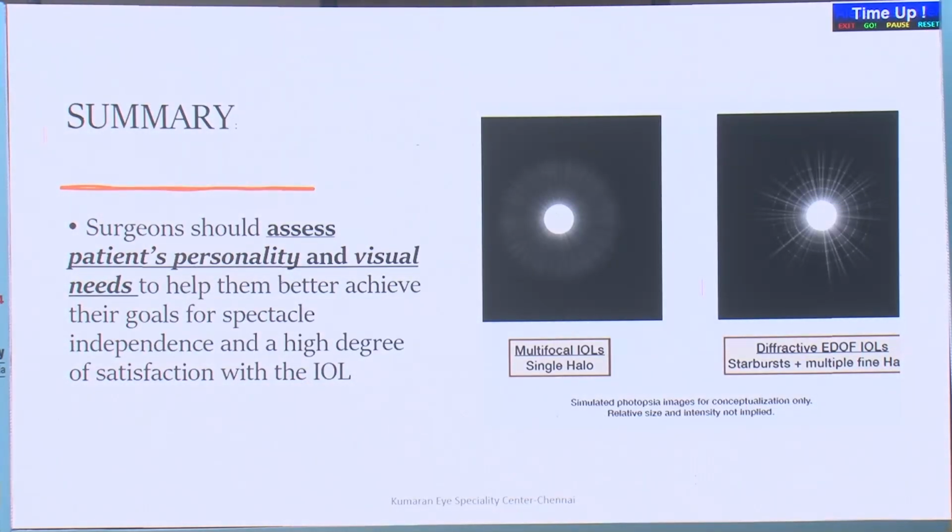So finally, with all these studies, talk with your patient, understand him, make him understand the realistic expectations of what these lenses would give you. I have a negative counseling for all my patients. I tell them, you would definitely need a 0.75 or a 0.5 diopter correction, like how we do a LASIK counseling. But for normal day-to-day life, you can be without glasses.